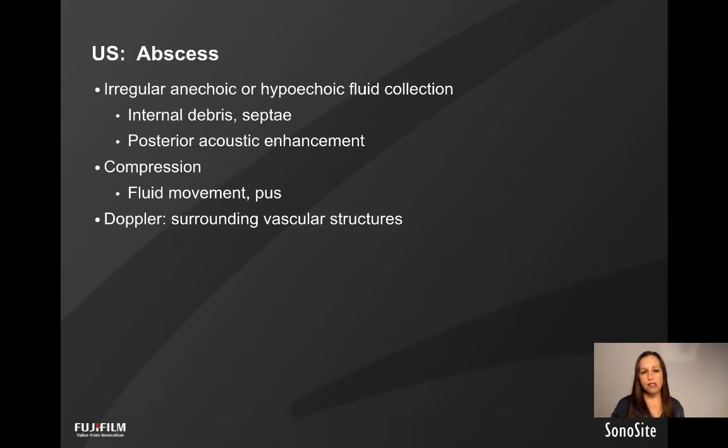Now, what do abscesses look like on ultrasound? They can look like a lot of different things. They're not always anechoic or perfectly dark. They may be anechoic, they may be hypoechoic, there may be internal debris, but because of fluid inside of those abscesses, there may be posterior acoustic enhancement.